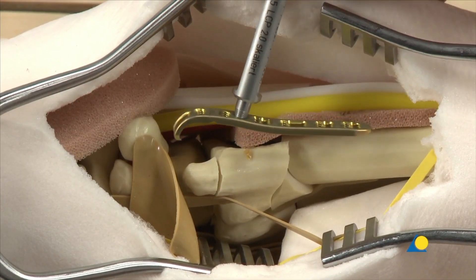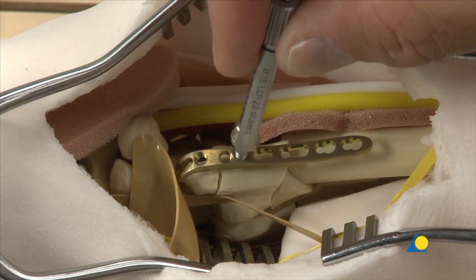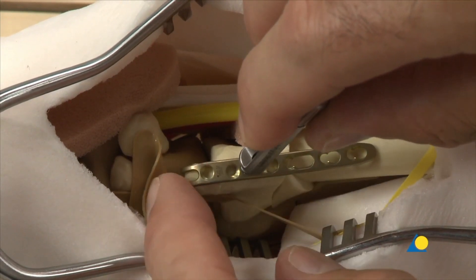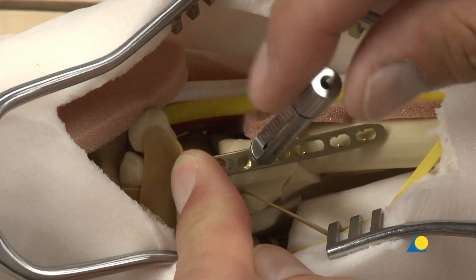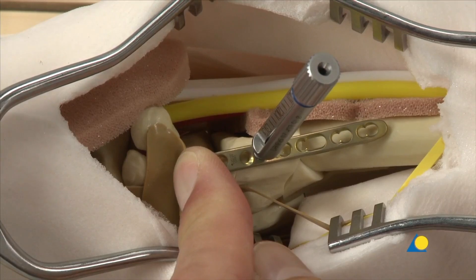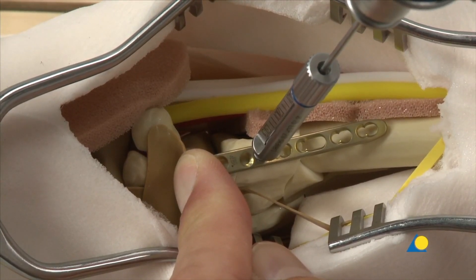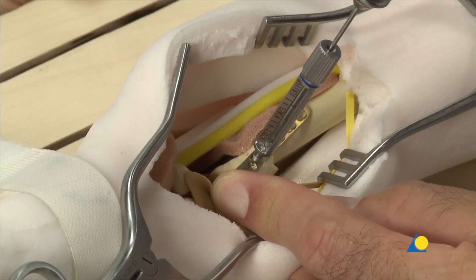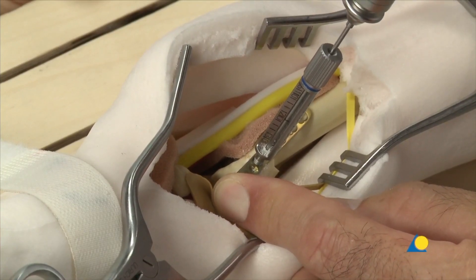The plate is positioned on the bone with the threaded 2.0 LCP drill sleeve. The hooks of the plate should be secured around the tip of the styloid. The 2mm drill bit is used to create the screw hole. The depth of the hole can be read from the scale on the sleeve and the mark on the drill — in this case 20mm.